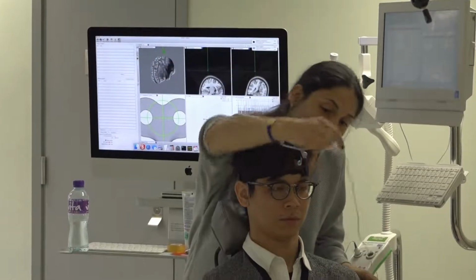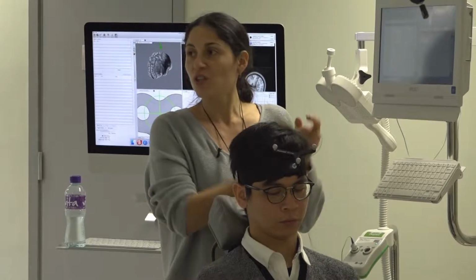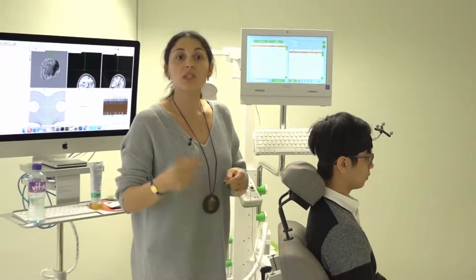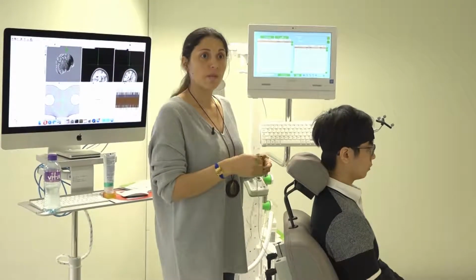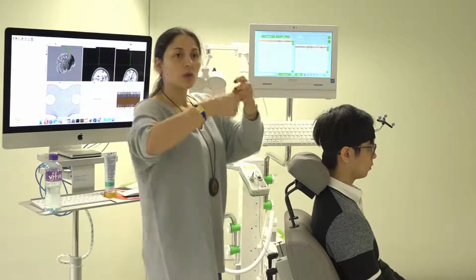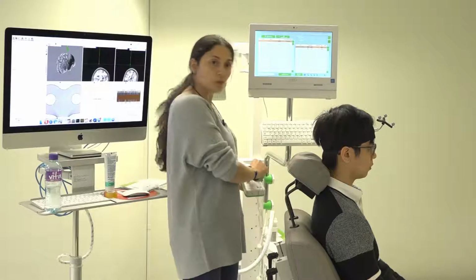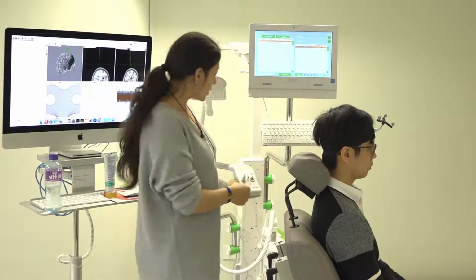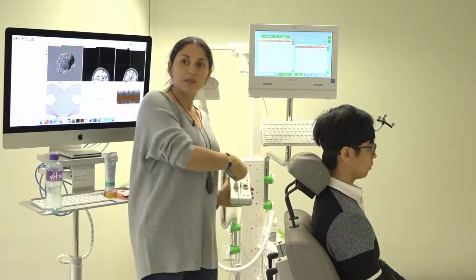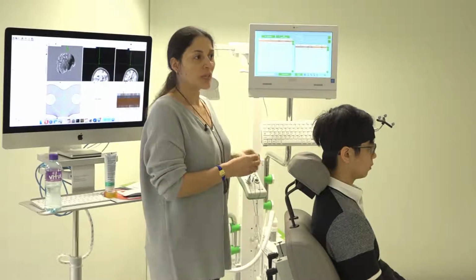Sorry. Probably this is not the best location when you are going to set up your lab, so pay attention to all these details. What is easier for you, what is easier for him, yeah? Comfortable for you mainly. And this is the ground. The ground here goes to PG. It says PG here. If you want, just check. Can you see? It goes in the middle. Yeah? Some more details, otherwise you didn't see it, and then you forget.